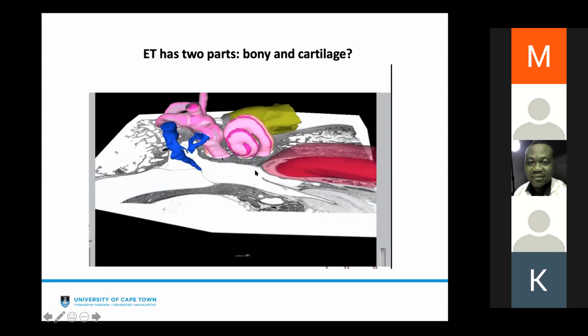And what has previously been done is there's just been an arbitrary line that has been placed saying that this is where the protympanum ends and this is where the bony Eustachian tube begins. But if you look at some of these images and when you look with the endoscope in the protympanum, some of these questions are begged to being asked, because perhaps the Eustachian tube is just a saccular or a tubular structure without any bony component.